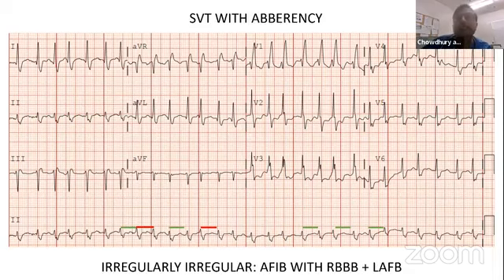And unlike the previous EKG, look at the ST segment on lead aVR. There is no ST elevation; the elevation looks like part of the QRS, not a separate ST segment elevation. And the ST depression here, which I compared with the previous one, is not as profound as before. So clinical context is very important in how you treat these patients.